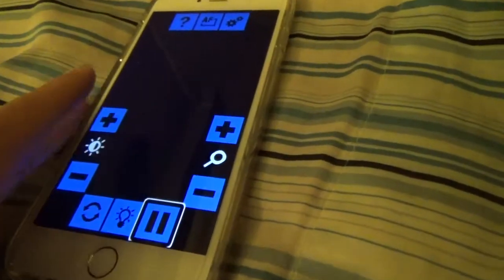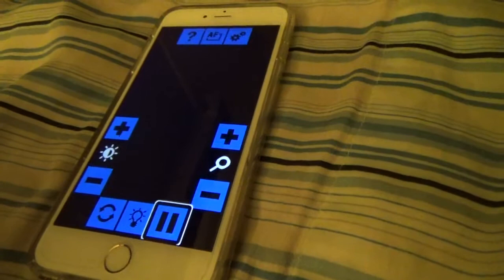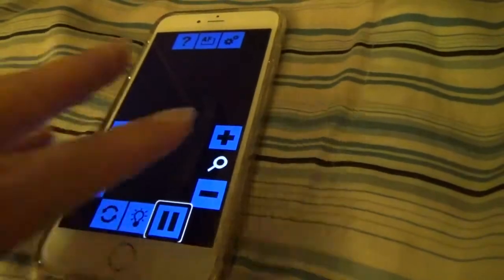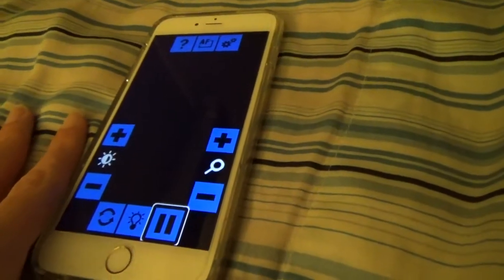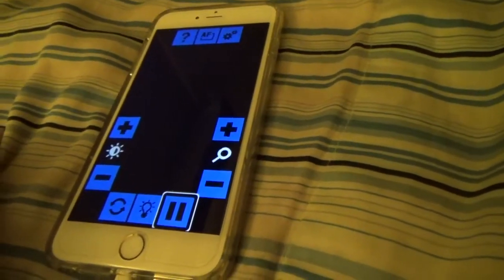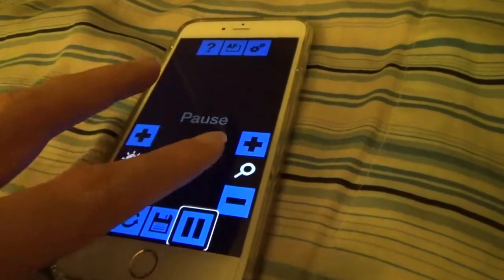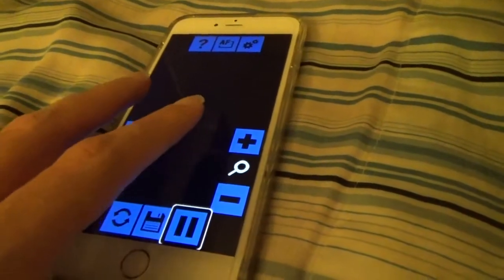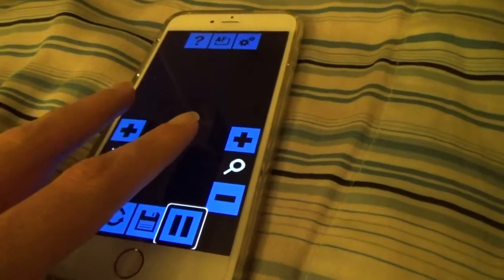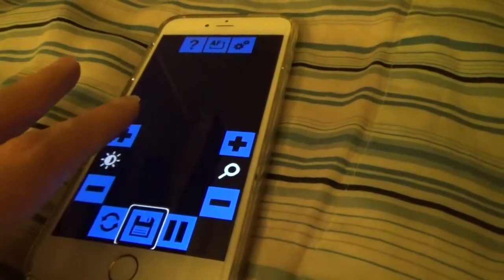Pause display button. So pause display. You can actually pause a live feed, and so for instance, I could pause it at an overview and zoom in and pan around and do all kinds of really nice things. Again, it's the exact same features of the dedicated video magnifiers. So if I hit pause, pause display. Let's go back 1 button, because there was a button that said activate torch. That is the bottom center, right above the home button. This is assuming portrait orientation, by the way. If we move back 1 to the left, save image button.